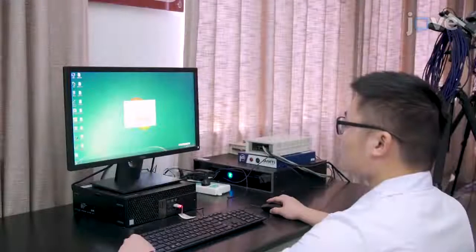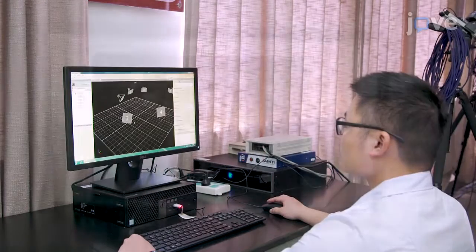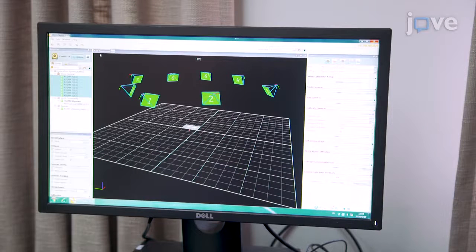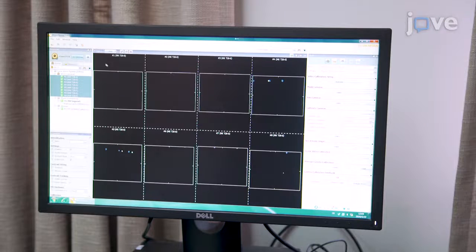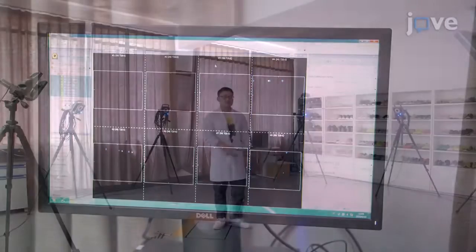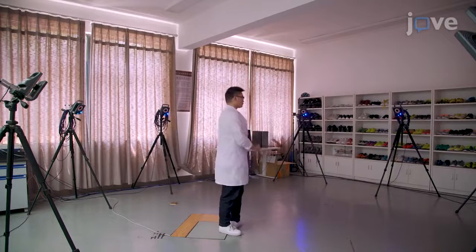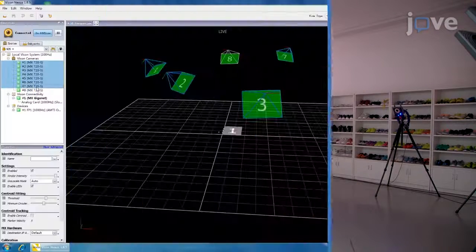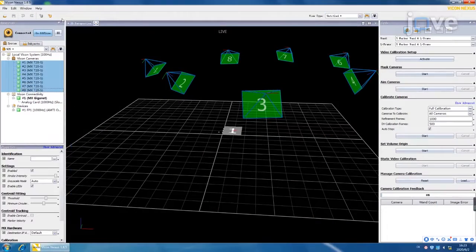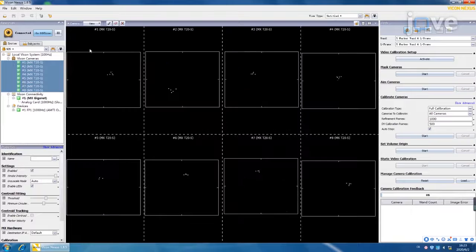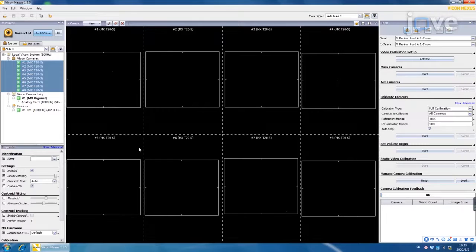To engage the cameras, open the software and select System, Local System, and MX Cameras in the Resources pane. Place the T-frame in the center of the capture area. Select all of the cameras in the system and select the 2D mode. Confirm that the T-frame is in the camera view without any interference points and select System Preparation.